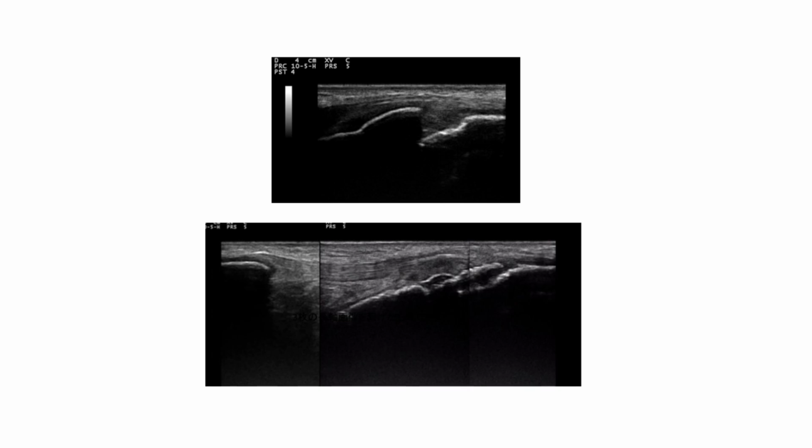Why is the tibial tuberosity so vulnerable? Looking at the echo image, the cartilage of the tibial tuberosity can be observed dark with low echo, and it can be seen that it is softer than the surrounding bone tissue.